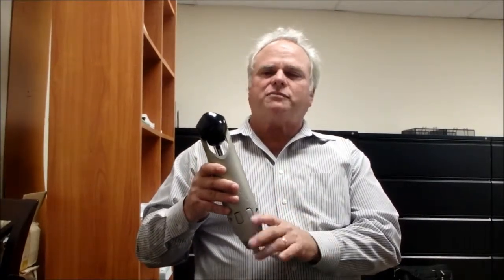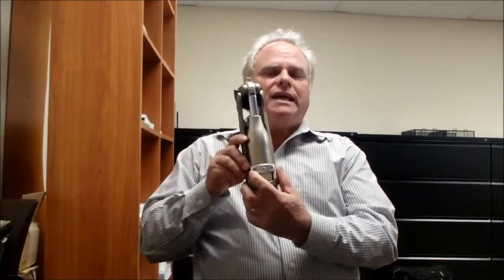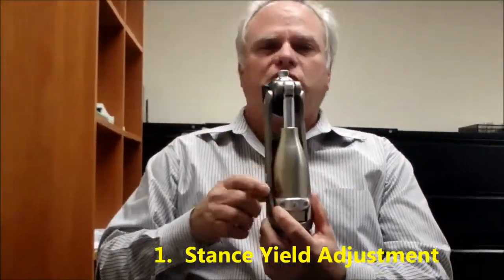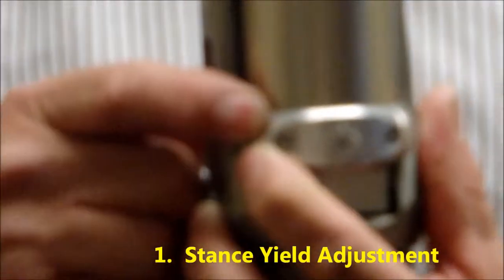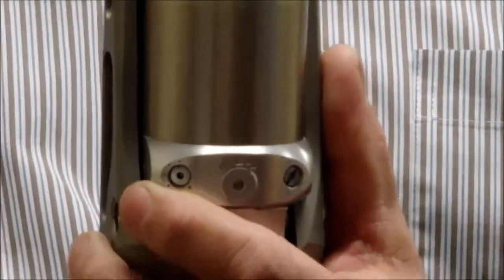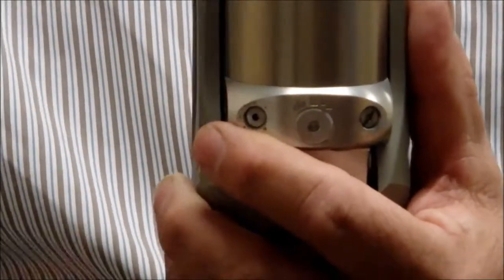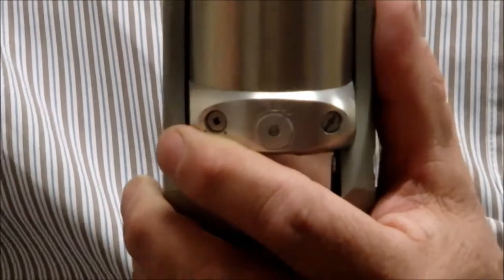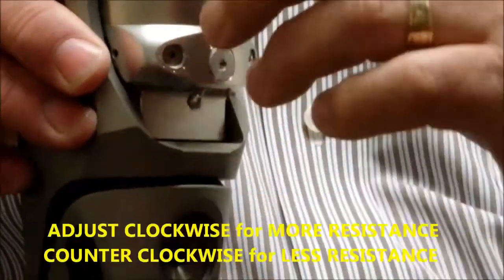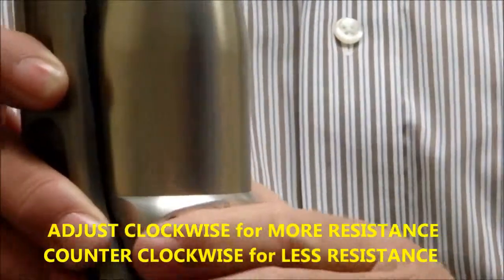So I want to start off with step 1 through step 4. The first step we're going to do is the stance yield. This is the sitting where you first control them sitting in their seat. When you want the knee to help them sit down, they want resistance in sitting — it gives a nice long stroke and it'll help them all the way down to the chair. You adjust this clockwise for more resistance, counter clockwise for less resistance. Very simple.